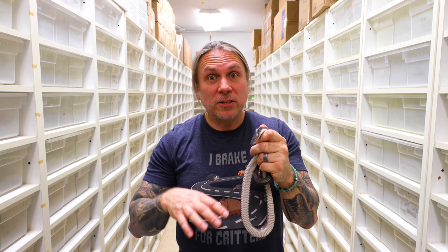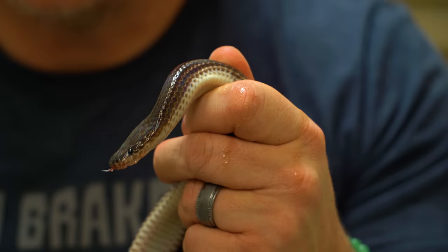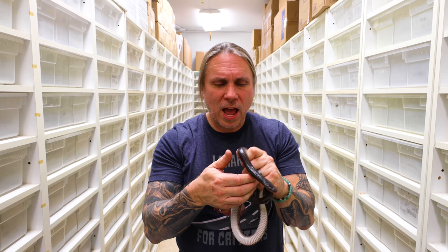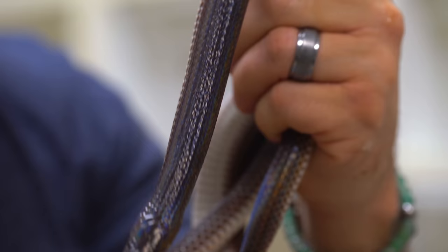I want to hold the snake up as far as I can and just kind of massage down. I don't want it to actually spit up the stuff I just tubed down. I'll probably hold it like this for a good minute or two. Hopefully all of that nutrition, medication, and hydration will be great. I'm going to give this maybe a week and depending on how it looks, I'll either offer it a really small meal or tube it one more time. This one looks really good, so I have a feeling in a week I'll be able to just go ahead and offer this one food. You can see its tongue is flickering — now I know it's not going to spit anything else up. That's the way that you medicate a snake.